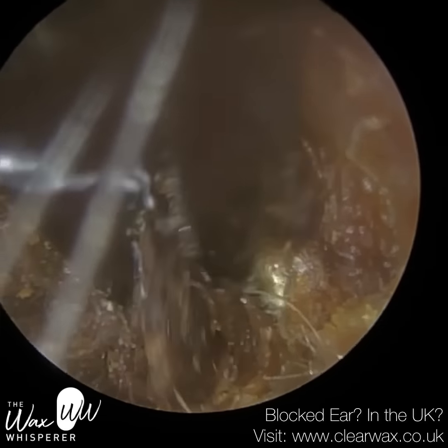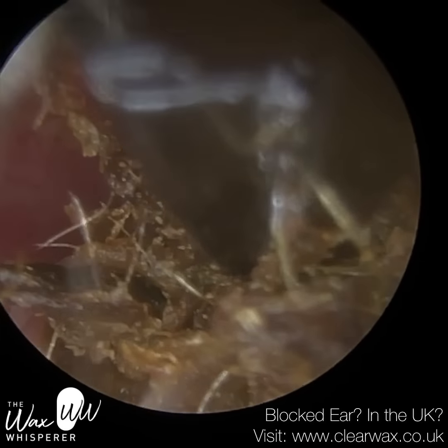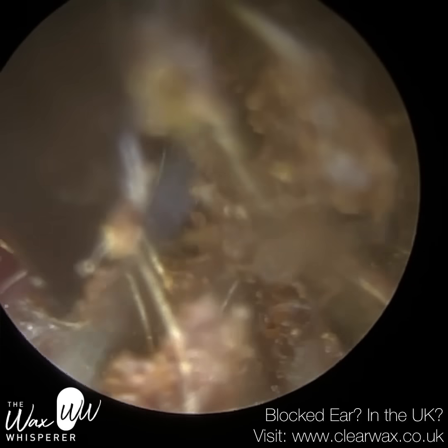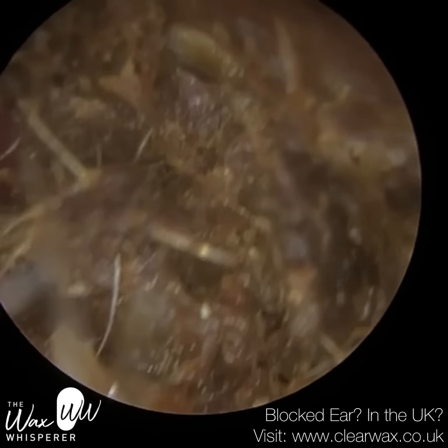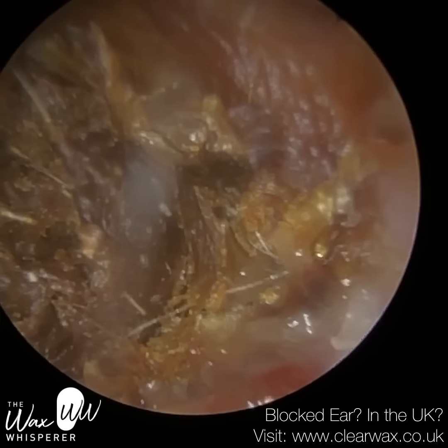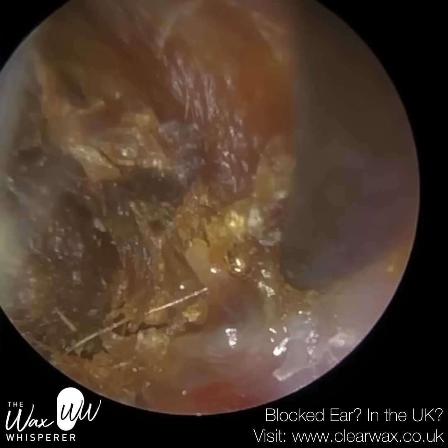And the forceps, they did assist. I was hoping to get more out of the forceps, if truth be told, but because this keratin is extremely adhered, not only to the floor of the ear canal, but also to the eardrum itself, the forceps themselves are just not powerful enough to pull this away. So with the ear pick and the ear hook, I was able to leverage, and you'll get an idea here.